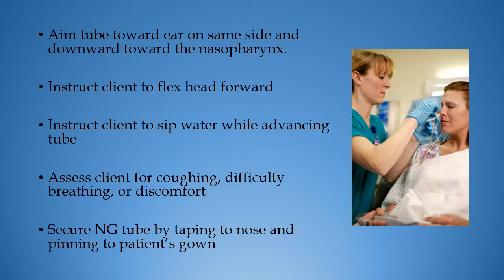Assess patient for coughing, difficulty breathing, or discomfort. Secure the NG tube by taping to nose and pinning to the patient's gown.